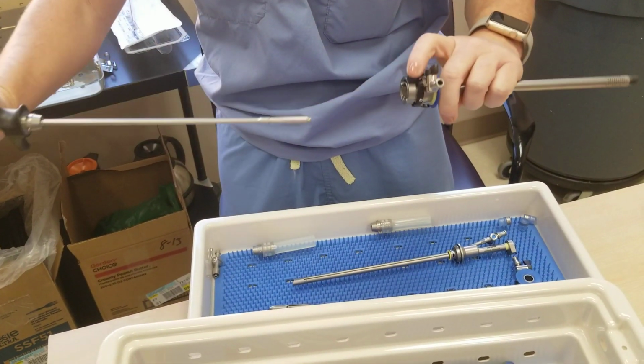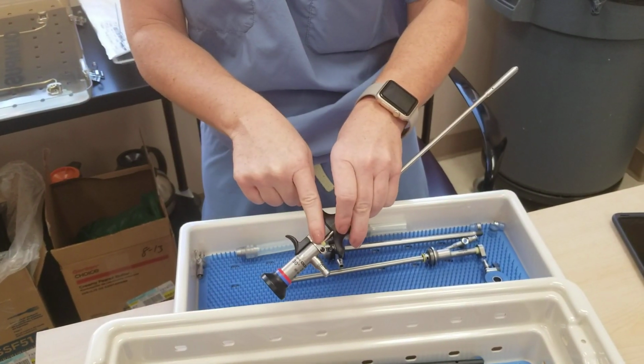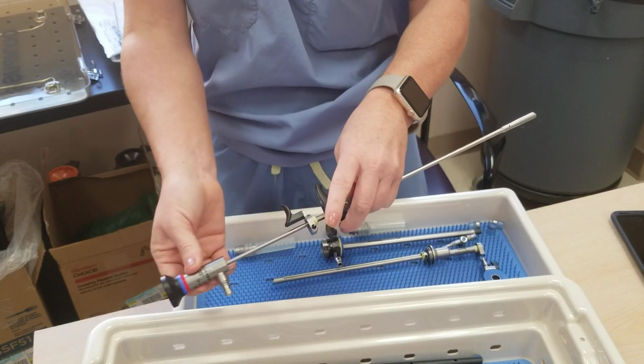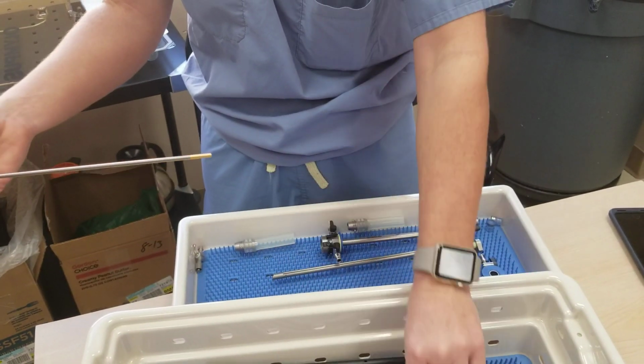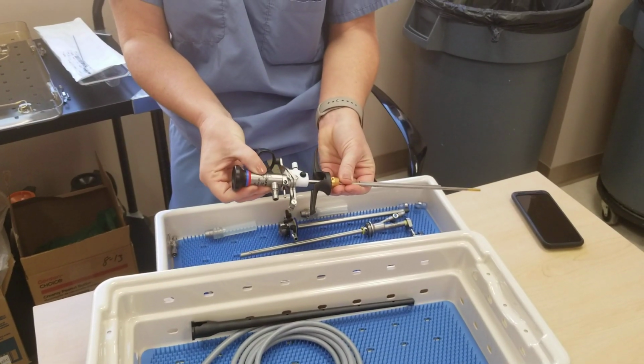They'll hand this back to you. This is still on the patient, obviously. To remove the lens, there's a little black dot next to the lens. You'll press that. You don't need that anymore. Here is your working element. This connects the same way, snaps in.